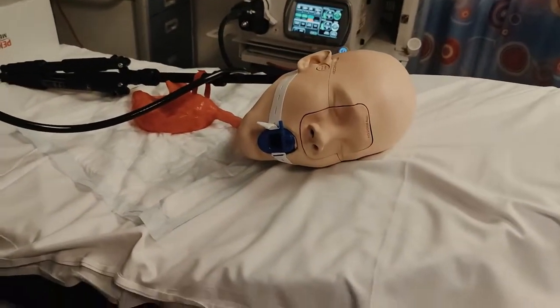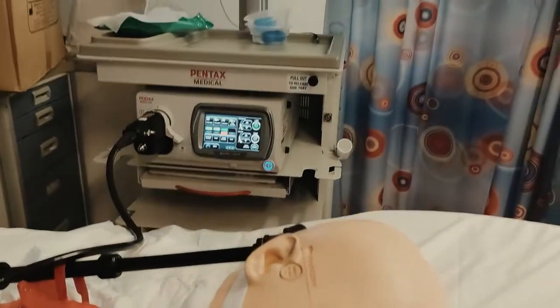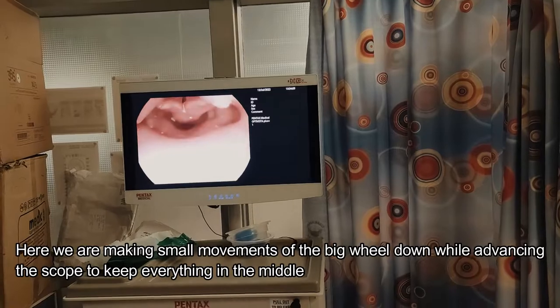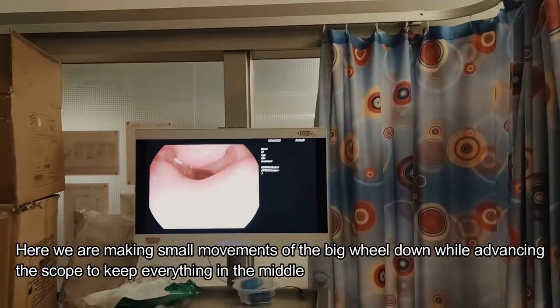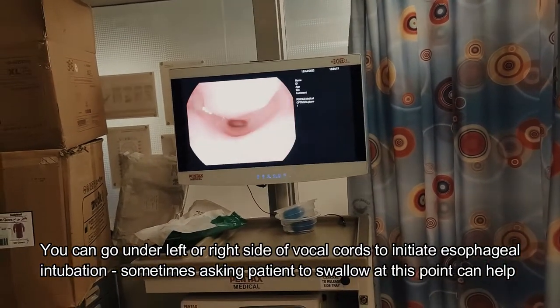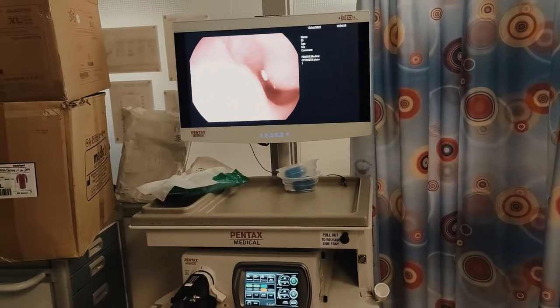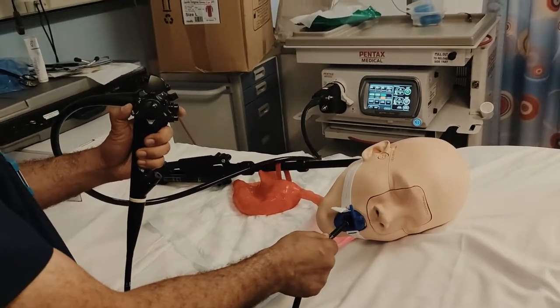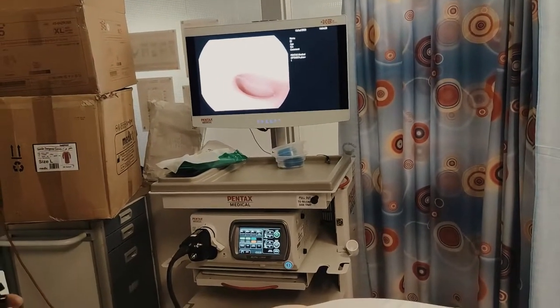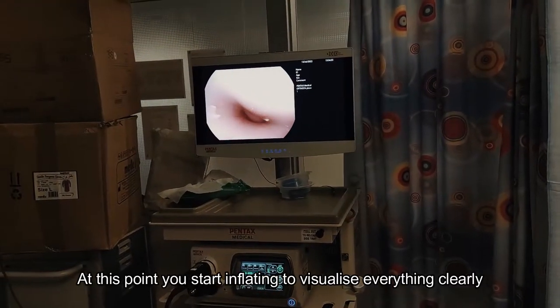He will center the scope into the middle of the mouth, having a look and then, once sure it's in the middle, looking at the screen to make sure it goes right along the middle of the tongue. As he moves forward, pressing down on the wheel, he can now see the vocal cords, and in a real-life patient under the left or right side you'll see the pyriform fossa. Dr. Havari would normally go left to right, but in this dummy scenario it's right in the middle. He keeps everything centered, knowing exactly which way the scope is going to go, pushes down, and centers everything right in the middle — now he has gone through the pyriform fossa into the esophagus.